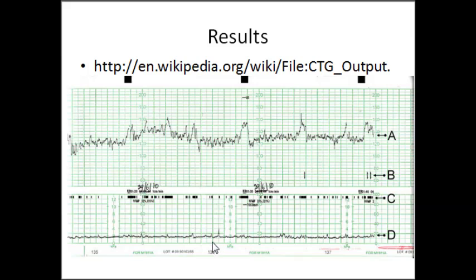Now one thing of note, the amplitude really doesn't matter, and I say that because in a really obese person, they have a lot of fat between the probe monitor and the uterus. So the contractions of the uterus really aren't picked up as well. The contraction of the uterus happens, and it really has to go through a lot of fat and tissue to reach the probe, so you won't get as big of an uptick. Conversely, a really skinny person may have a small uterine contraction, but there's not much tissue for the signal to go through, so it may appear as a large blip.